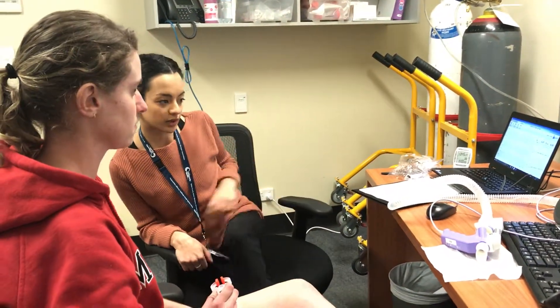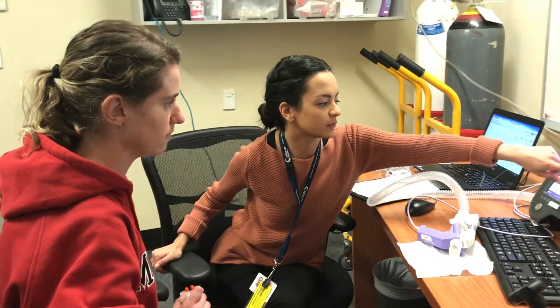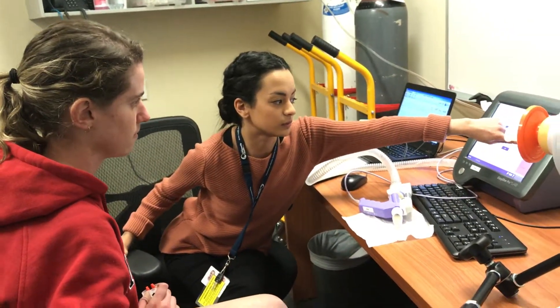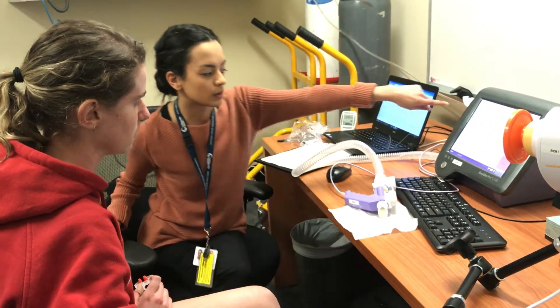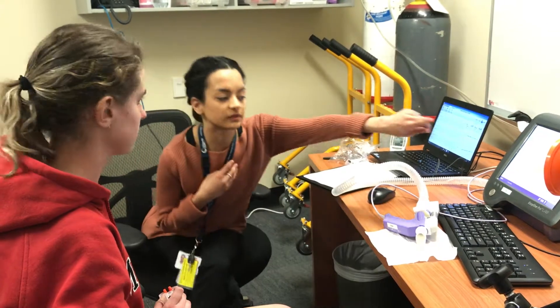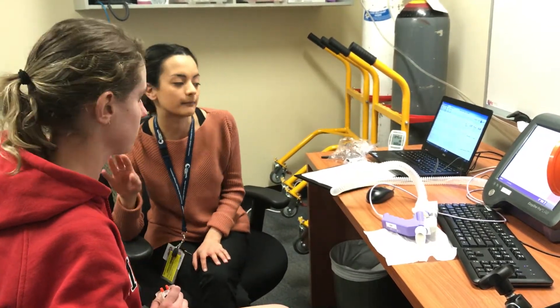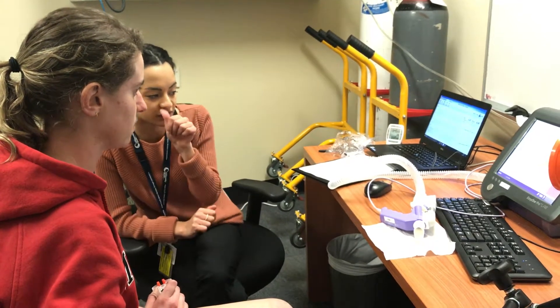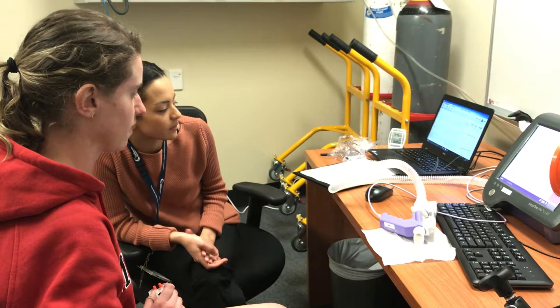For this one, we're going to get you to start breathing normally. You'll see a range on the right here. We then want you to be aiming, when I tell you so, for this light grey area. What's important is you're breathing in to this range here and breathing out all the way until you're empty before breathing in again into that range. We'll get you to do it a few times and I'll let you know when we're going to stop.